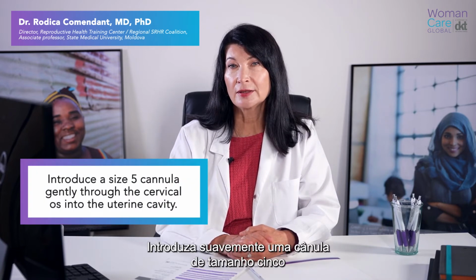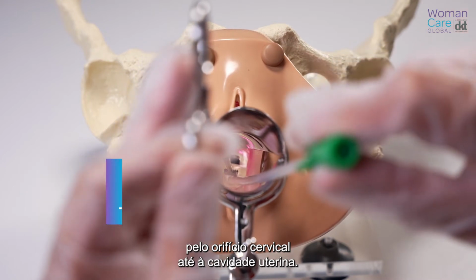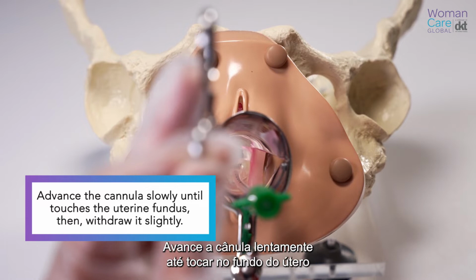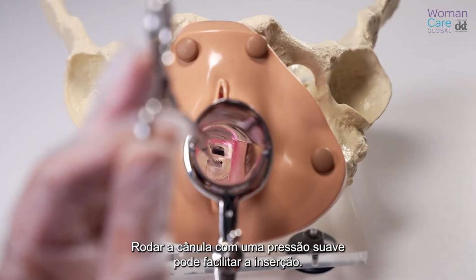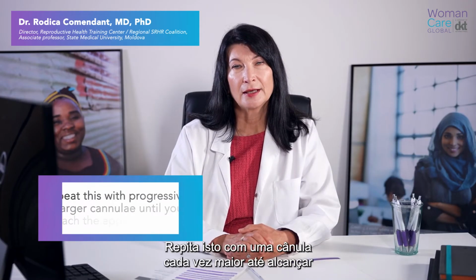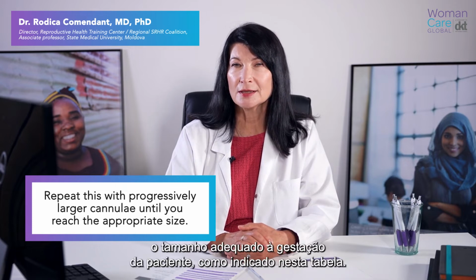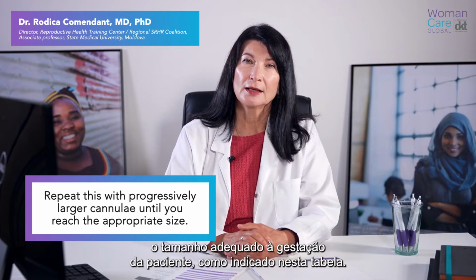Introduce the size 5 cannula gently through the cervical os into the uterine cavity. Advance the cannula slowly until it touches the uterus fundus, then withdraw it slightly. Rotating the cannula with gentle pressure can ease insertion. Repeat this with progressively larger cannula until you reach the size that is appropriate to the patient's gestation, as follows in this table.